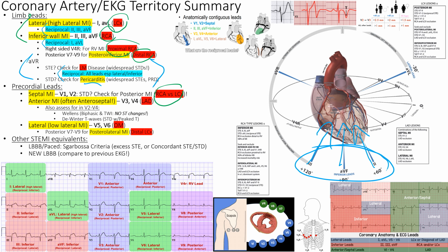Left ventricle fed by the RCA, right? So inferior leads are here in 2, 3, aVF, right there in the corner. It just checks a box for me. That's all there in one spot. Everything else is not in one spot. So 2, 3, aVF is right there in the corner. All right, over here is another way to look at it.